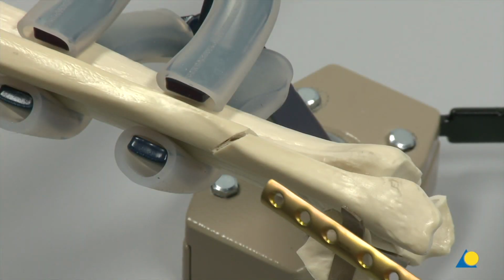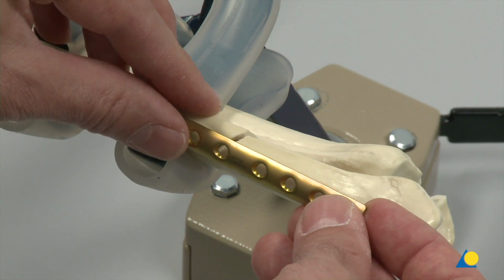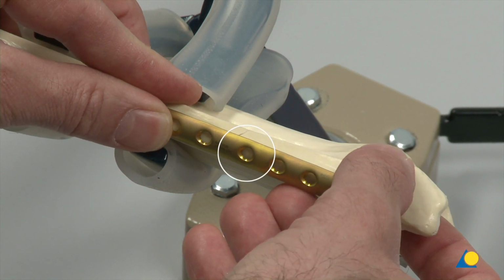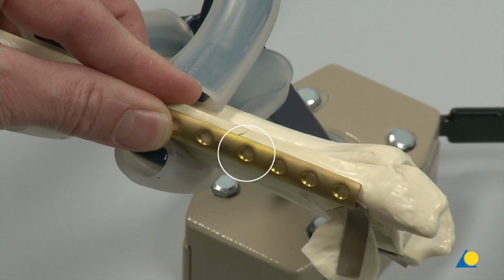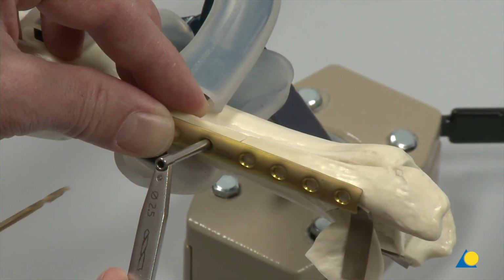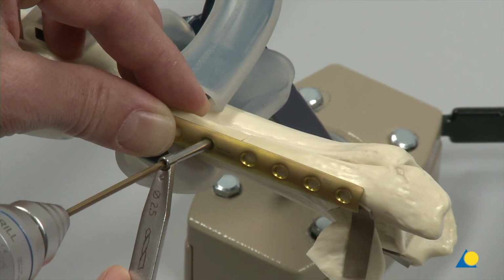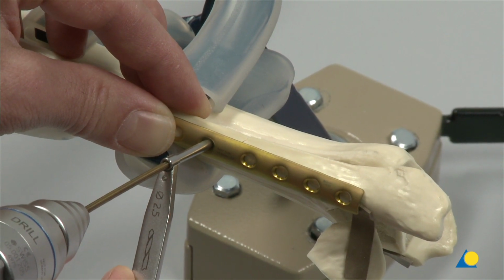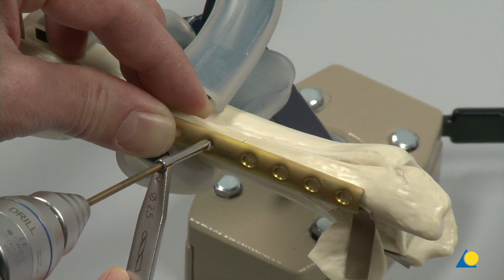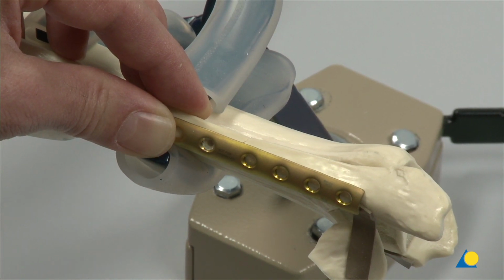The 7-hole LCP 1/3 tubular plate is placed onto the bone with the middle hole distal to the fracture. This hole will be used for the lag screw. Contouring is not necessary. A neutral hole is drilled through the 3rd proximal plate hole close to the fracture using the 2.5 mm drill bit and 3.5 universal drill guide.